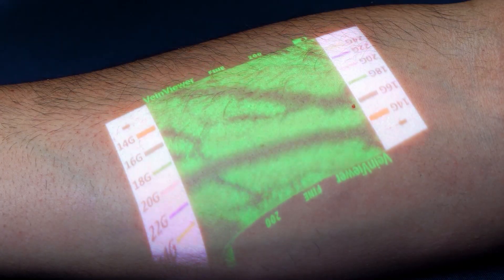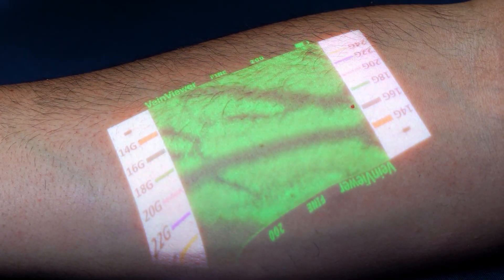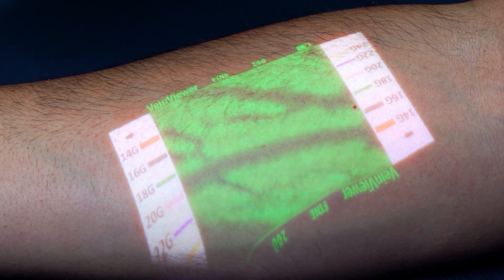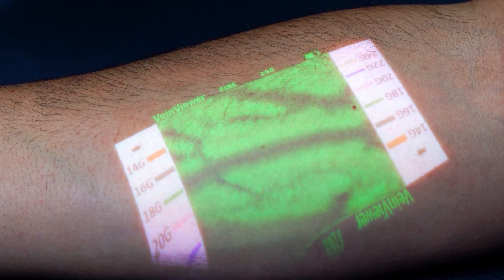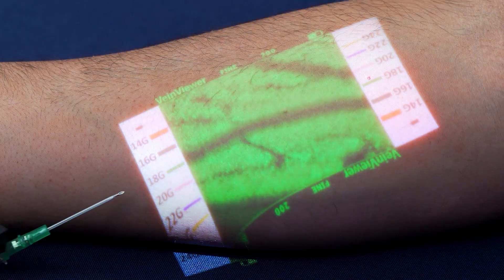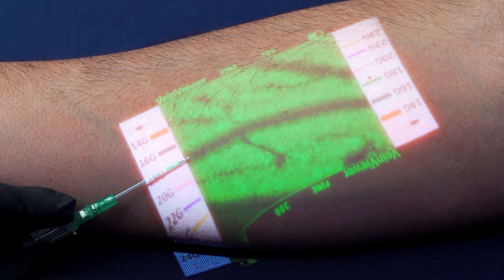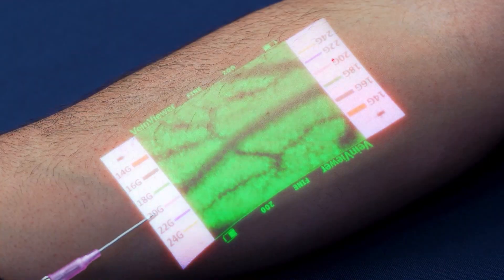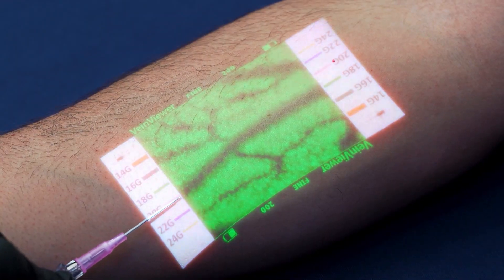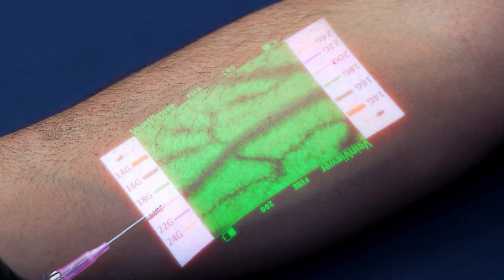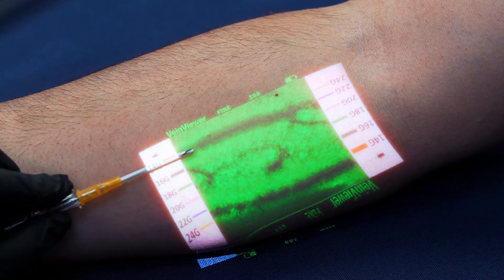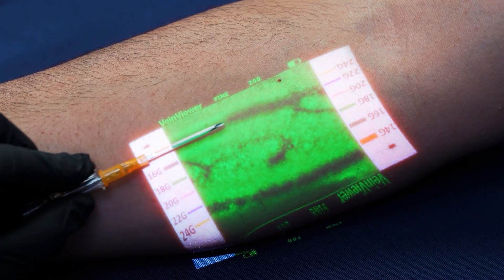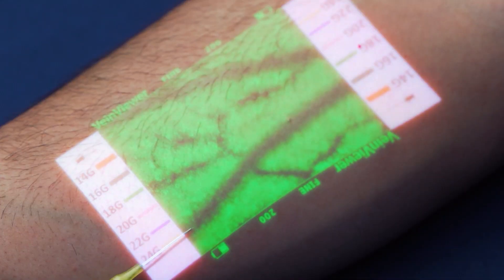To utilize the catheter sizing reference graphic, align the colored size marking to the chosen vein. Rotate the VeinViewer device to compare each catheter size for the appropriate selection. Place the chosen peripheral IV catheter on the reference graphic and selected vein for additional comparison or evaluation prior to insertion.